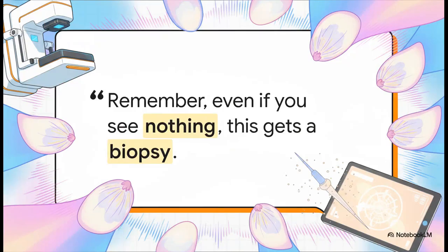And listen to this, because this is maybe the most important point of all. Architectural distortion can be so sneaky, so subtle that sometimes it doesn't even show up on the ultrasound. It's just invisible. But here's the thing. It doesn't matter. The initial finding on the mammogram is considered so suspicious that even with a totally clear ultrasound, the recommendation is exactly the same. This needs a biopsy. We have to know for sure what's going on.